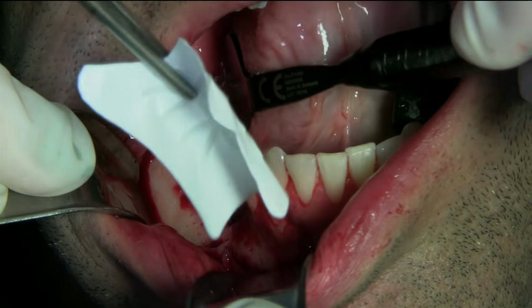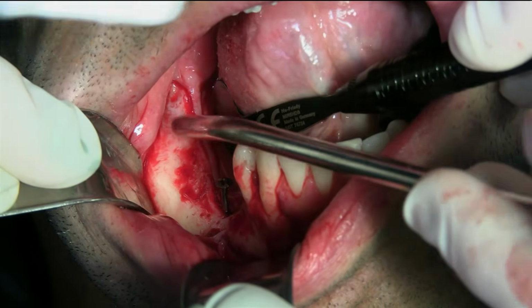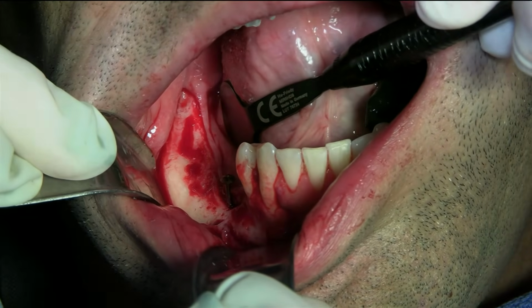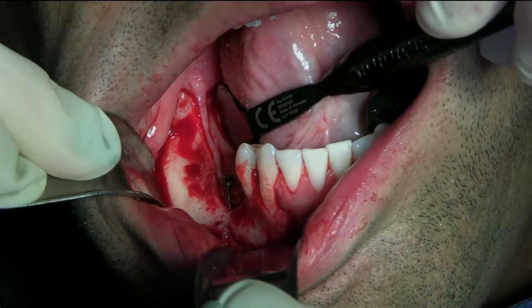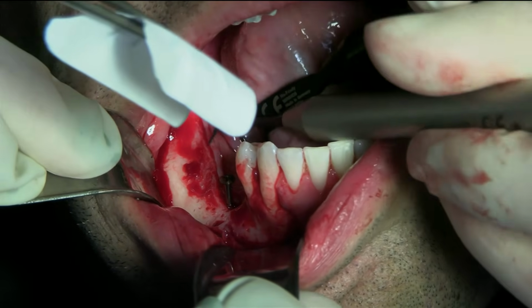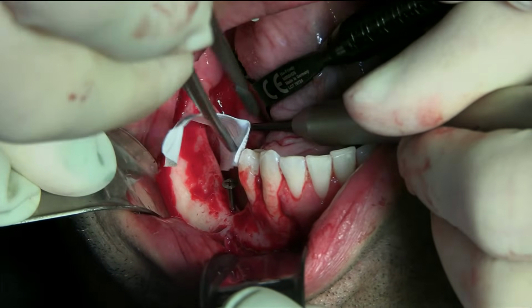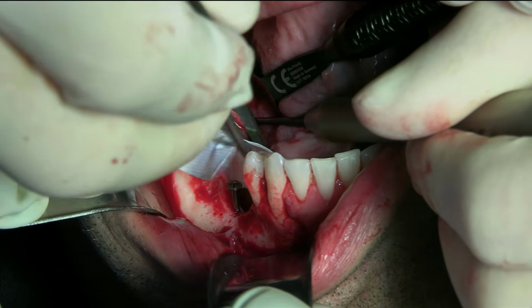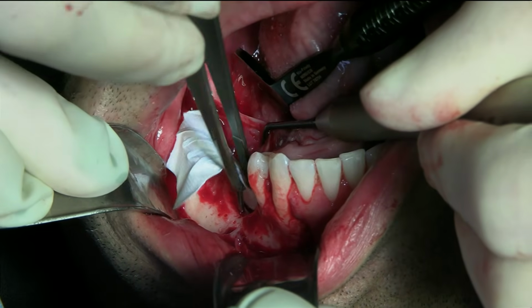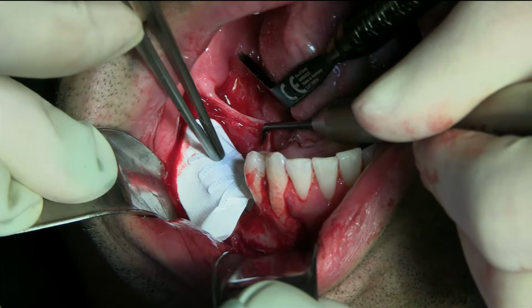So that's your membrane. That's the space. No. We're going to tease the membrane underneath the lingual flap. Suction in the buccal.